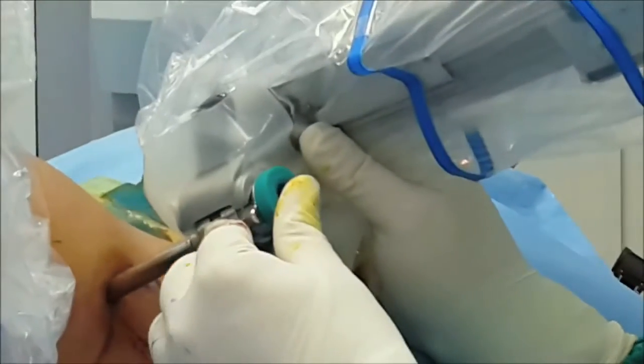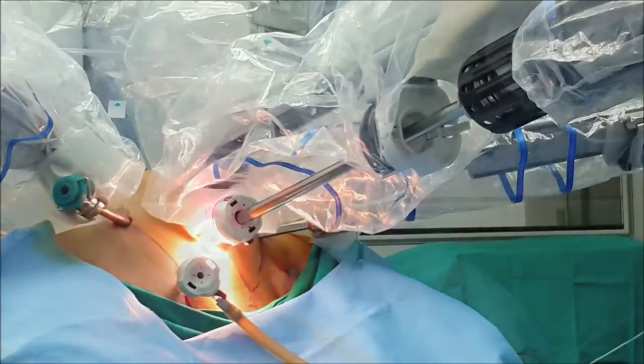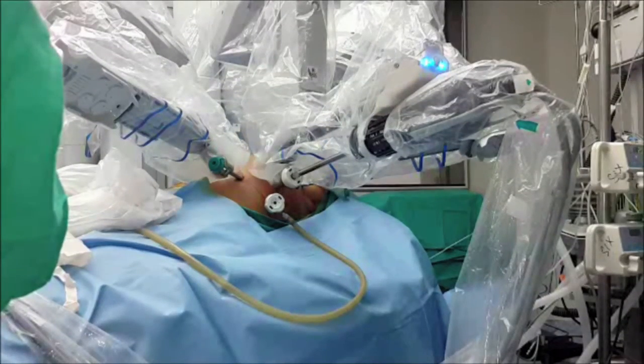Initially when we started our robotic port placement and timing for thymectomy, it would take somewhere around 35–40 minutes. But now I am able to complete the entire port placement within 10 minutes and be ready for the surgery. That completes our thymectomy port placement.